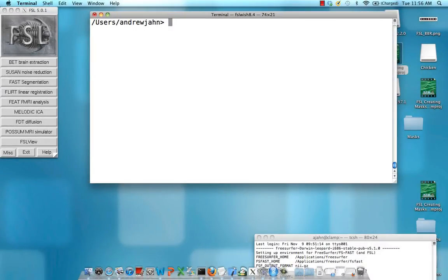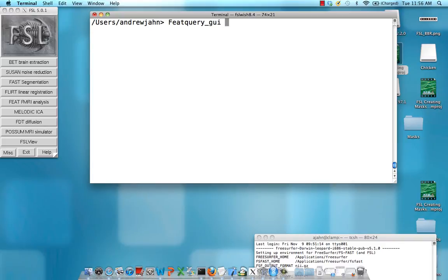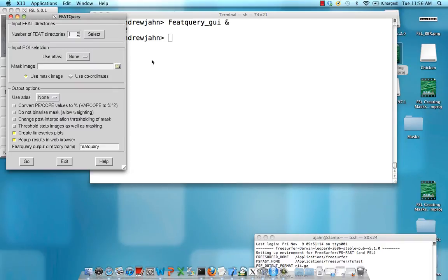Now that you have created a region of interest, you can extract data from that region using FSL's FeatQuery tool. To launch this from the GUI, type in FeatQuery with a capital F underscore GUI.